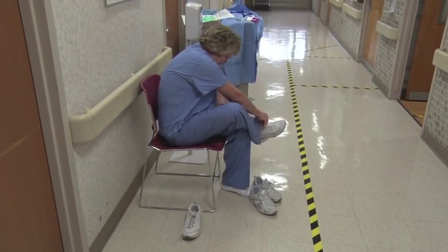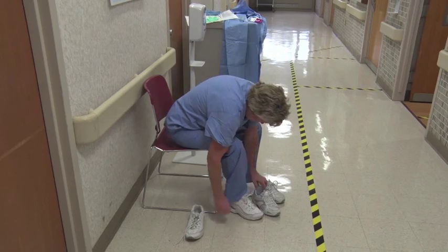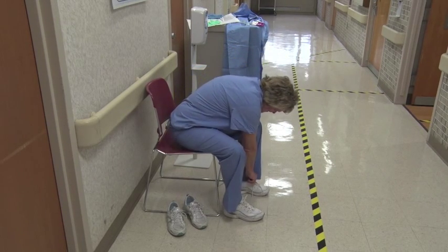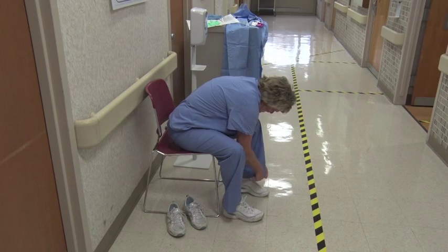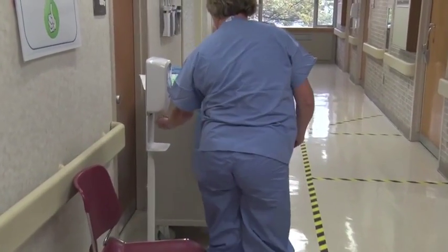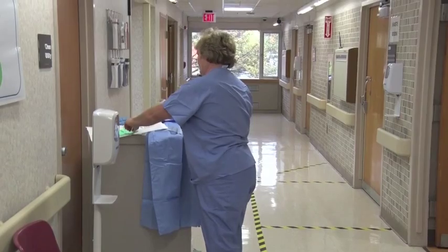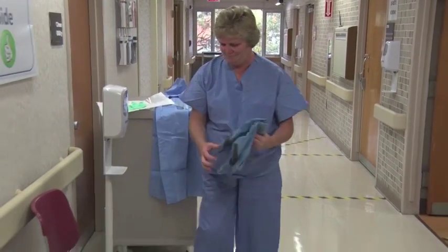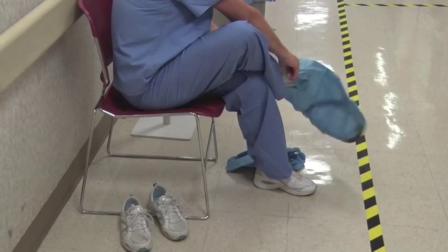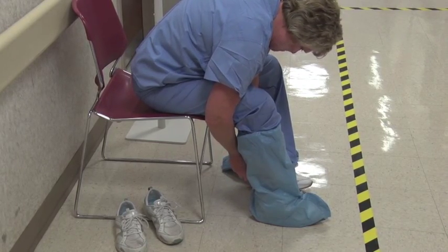During this video we are using personal shoes; these will shortly be switched out to hospital shoes. Perform hand hygiene. Put on boot coverings, securing the strap around the ankle.